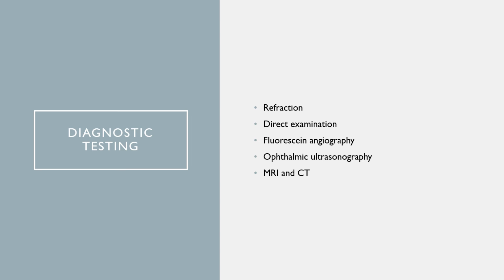All right, refraction. This is a test for visual acuity. It's performed with a phoropter, and a slit lamp is used to examine the anterior chamber of the eye. Okay, this goes into details: the lid margins, the conjunctiva, tear film, cornea, and the iris. Those can all be studied with this test. The pupil can be dilated and the lens and anterior vitreous can be examined.